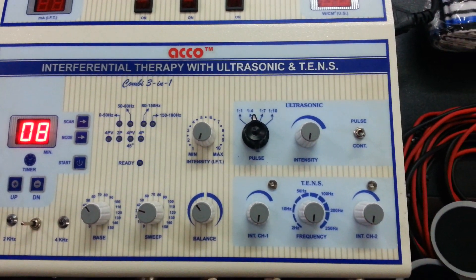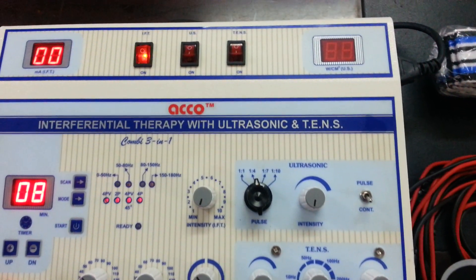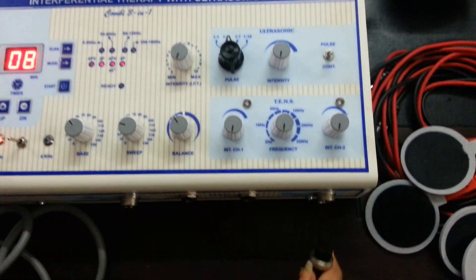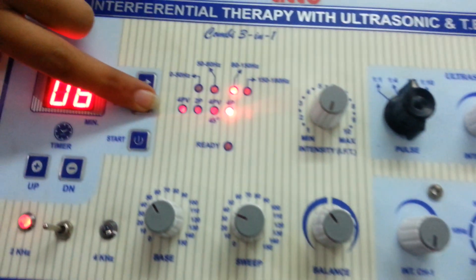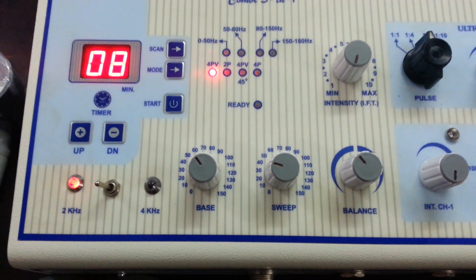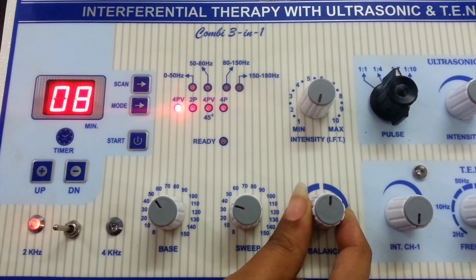Firstly we will show you the demo of the IFT unit. Switch on the IFT unit. Attach the wire and pads. Set the mode as per your requirement. Set the frequency as per your need. Make the balance knob at center.